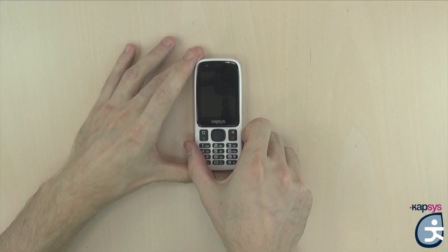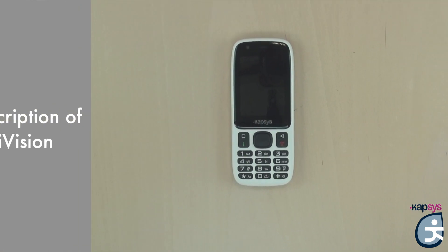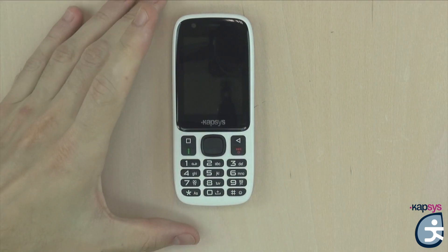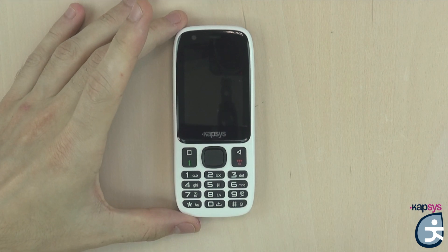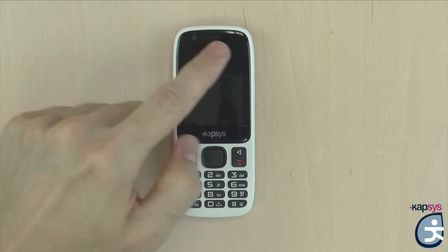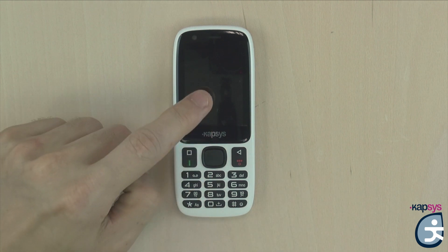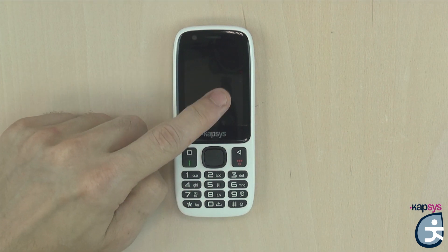Before starting the product and seeing the startup tutorial — that is to say, the first configuration — we will first describe each element of the Minivision. On the front of the phone you have a non-tactile screen that allows you to view the contents of the phone for the visually impaired or for people helping you use the phone. So no fear: if you touch the screen, nothing will happen.